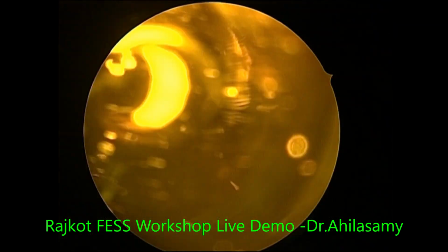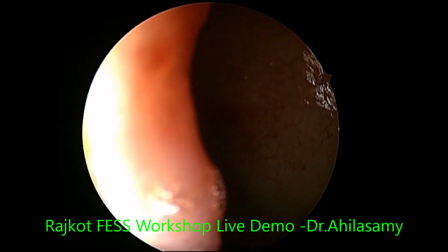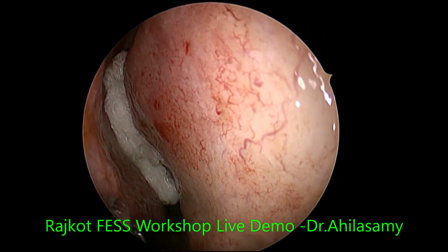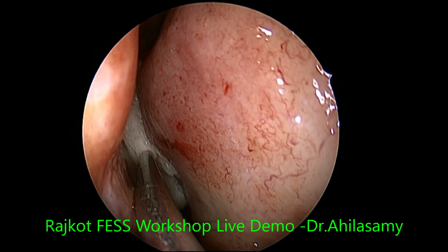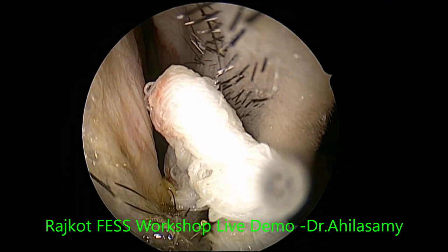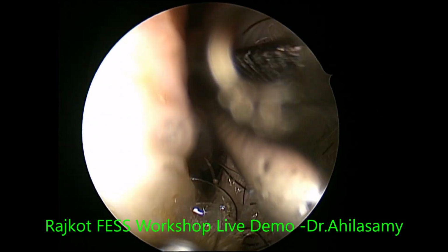Patients are very cooperative with good sedation and good infiltration, that is nerve blocks. So we have got a good decongestion in spite of a very narrow nasal cavity on both sides. The residents have trimmed the nasal vibrissae, which I don't do routinely, but this will help me a lot.